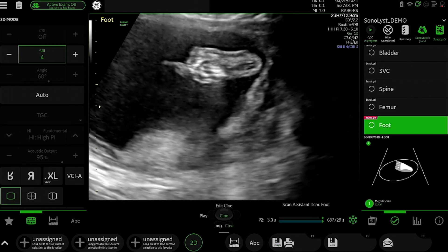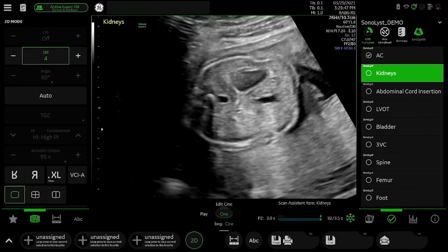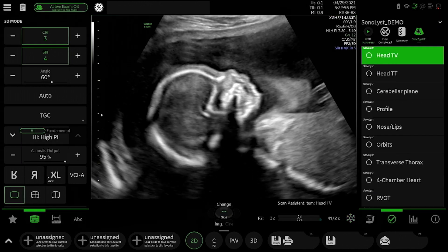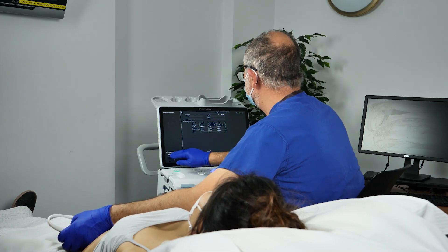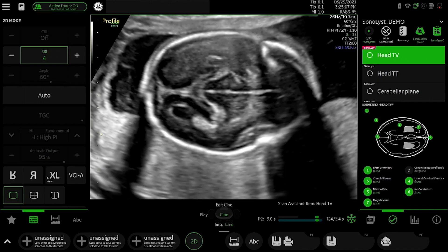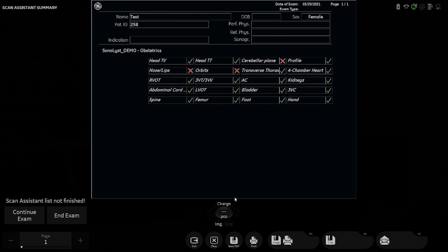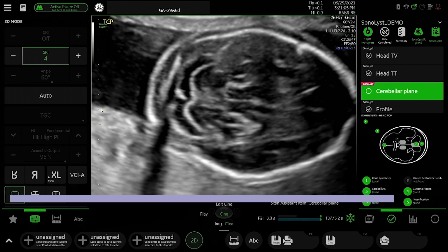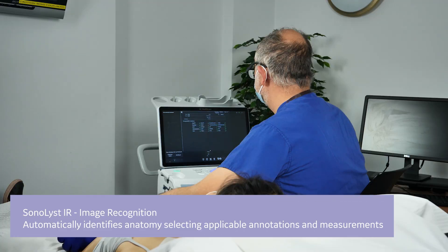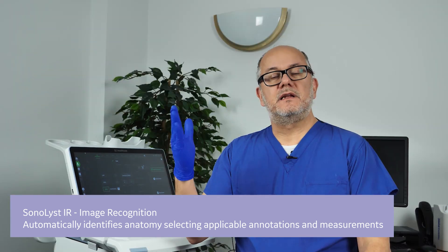It analyzes the quality criteria within each image. The aim of this AI algorithm on this GE machine is to do two things. The first thing it does is tick off automatically all the images required within a protocol. So as you do your ultrasound scan, it will tick off that it's seen the head, it's seen the lips, it's seen the kidneys, and so on.